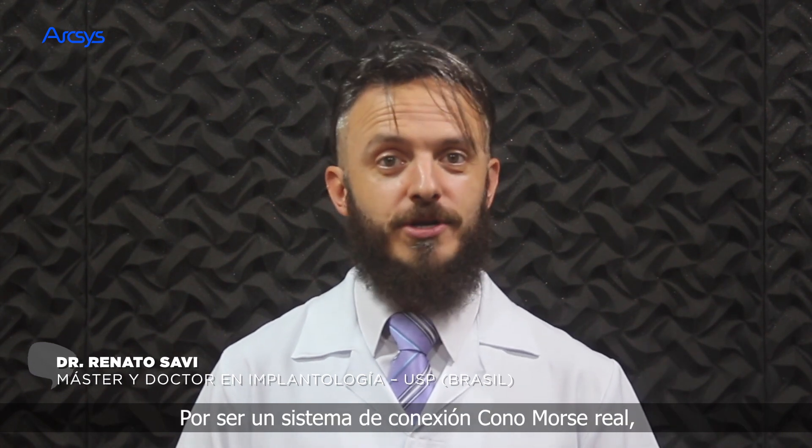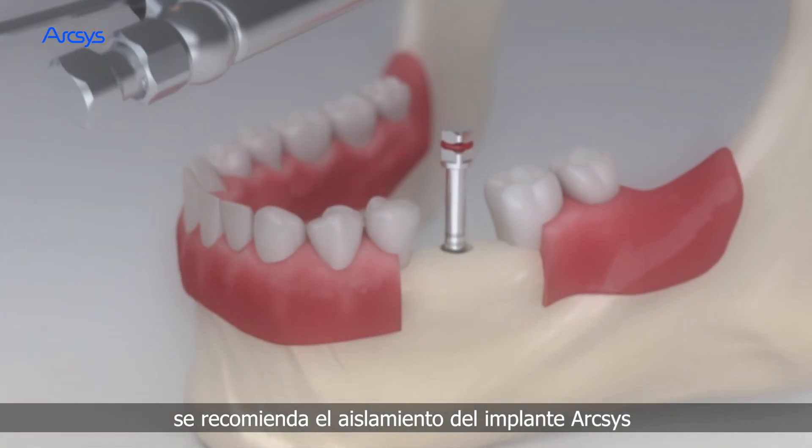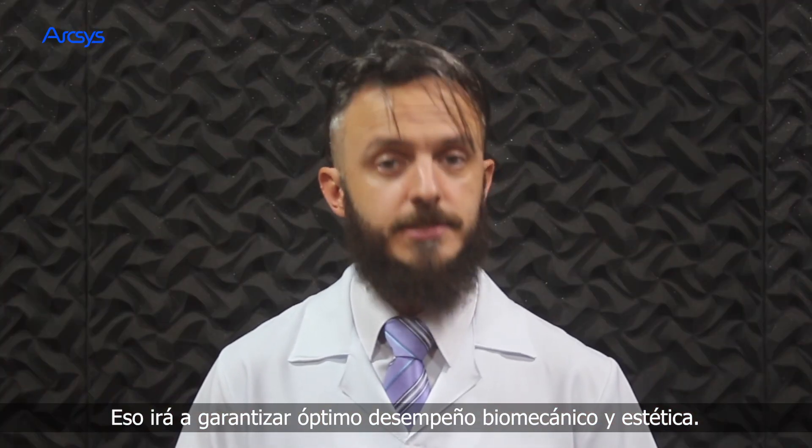For being a real Morse taper connection system, it's recommended to install the ArcSys implants about 2 mm beneath the alveolar bone crest. This will guarantee great biomechanical performance and aesthetics.